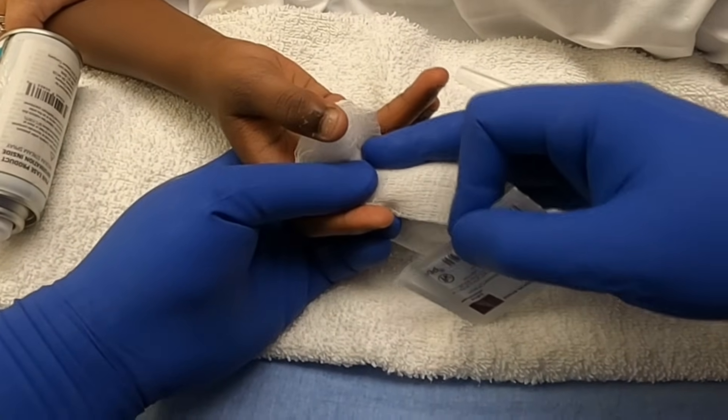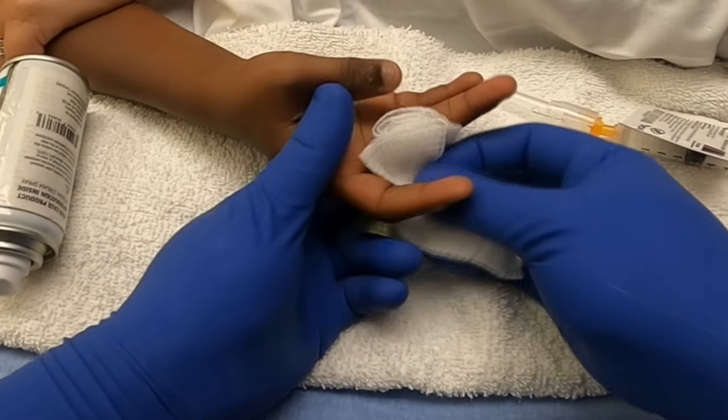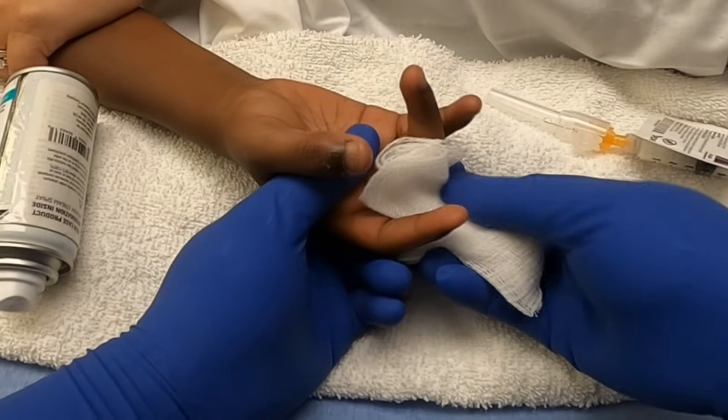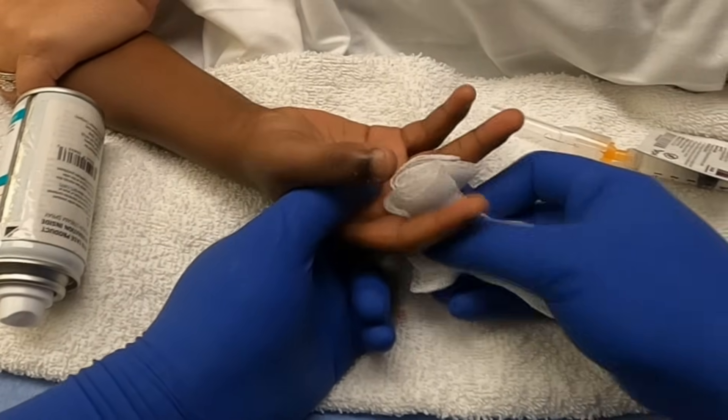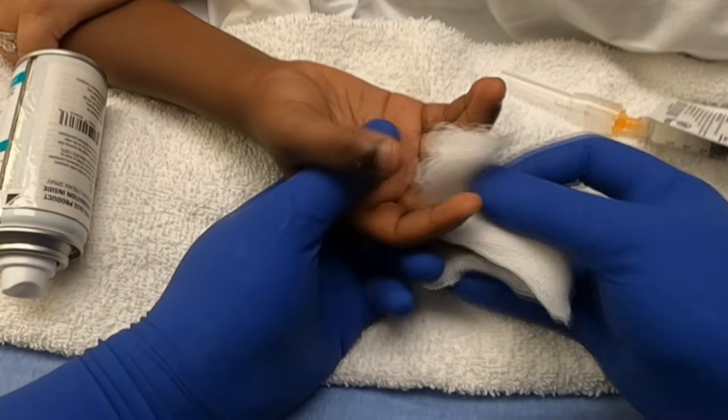Work that finger a little bit now — massage it in so that it really gets in there. Okay, all done. The hard part's done; you shouldn't feel anything else.